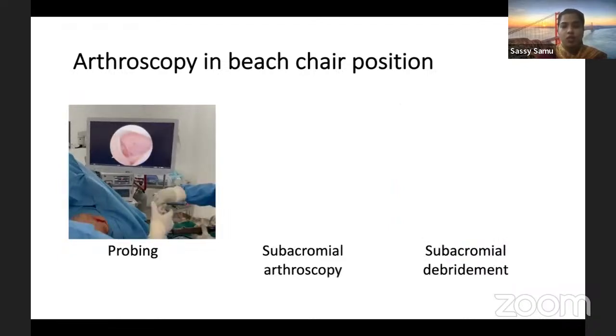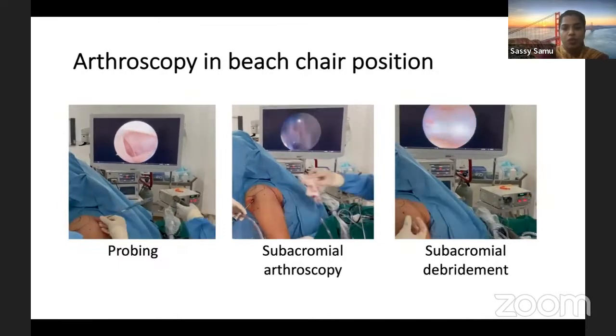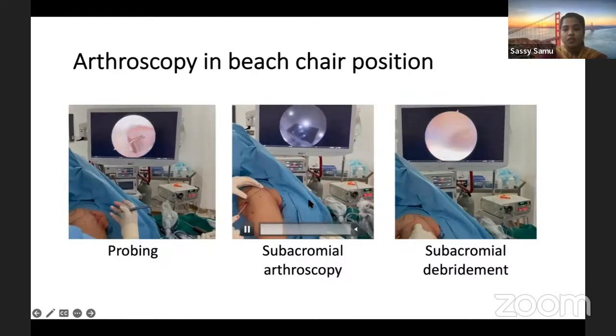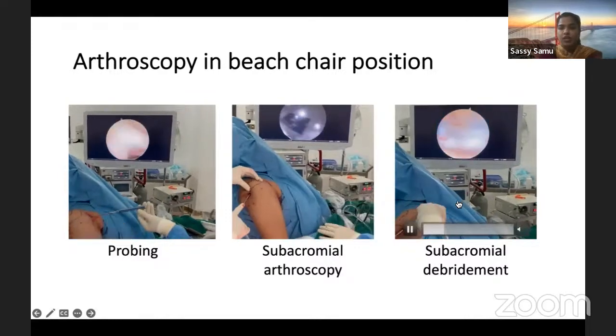The next is the subacromial arthroscopy. Here you need to slide just below the posterior process of the acromion and then get into the subacromial space. Using the shaver system, you start debriding the bursal tissues.